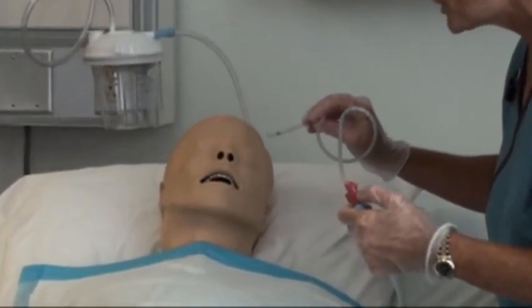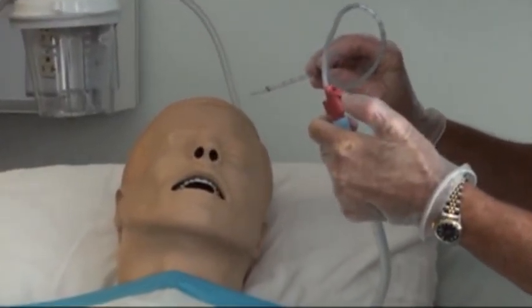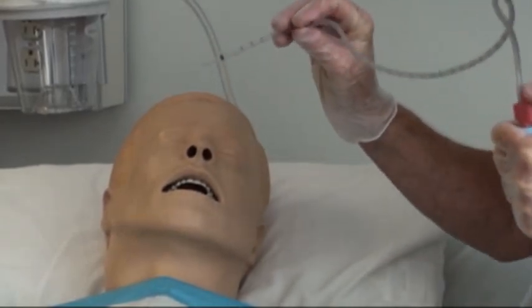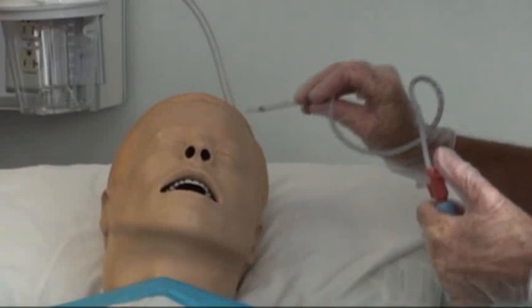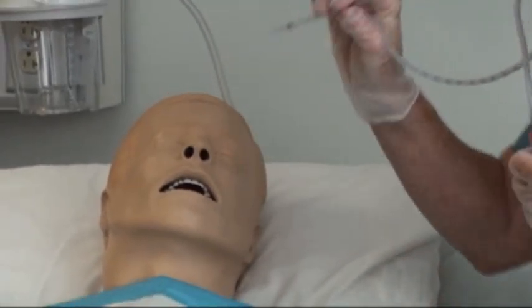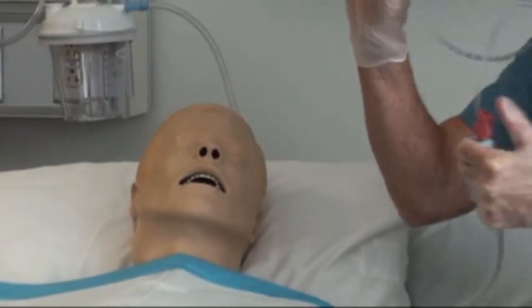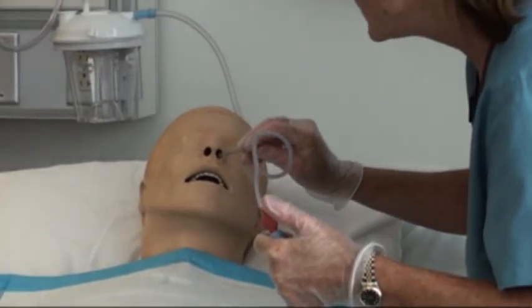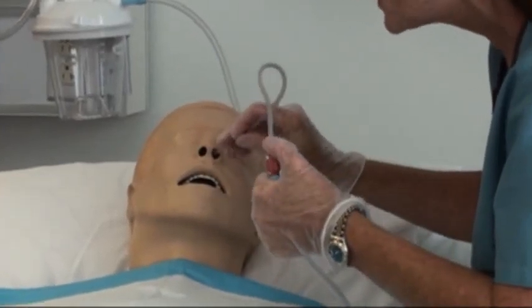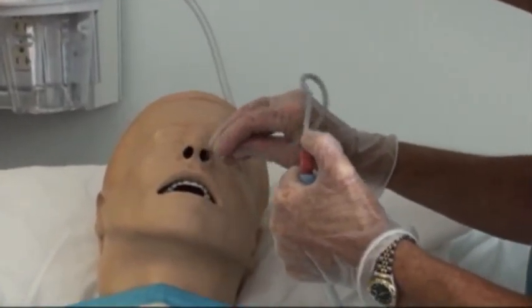I'm going to go back down one more time. Again, my finger's off the suction. When I get all the way down, I'm going to pill roll and intermittent suction coming out. My hand never touches her nose — it stays close but doesn't touch, because then I would contaminate my hand. So one more time: going in, feeding in. She's coughing — intermittent suction, pill rolling, coming out.